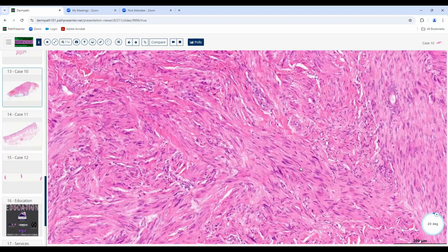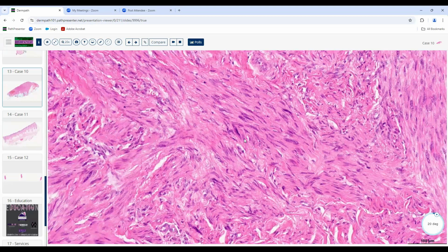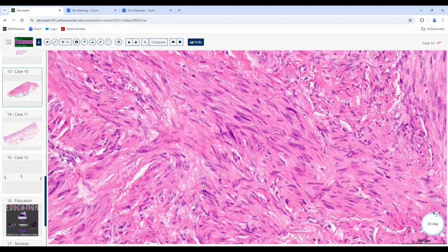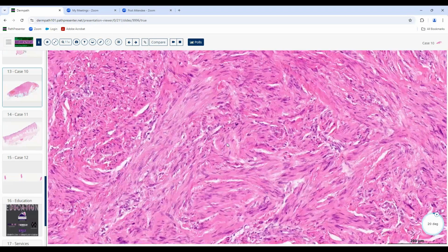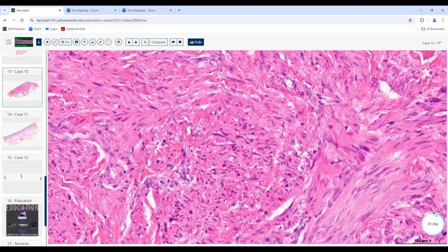Now, if we're looking at muscle differentiation, we use the same criteria for benign and malignant that we do at low magnification. So this thing is pretty big. It's a little bit asymmetrical. So you say, well, it may be malignant. And then you look at the cytology. You look to see if there are mitotic figures, if there's pleomorphism of the individual cells. And we do have some large, irregular muscle cells here. We're going to look through here, and you're probably going to see some mitotic figures. And there's one right there.